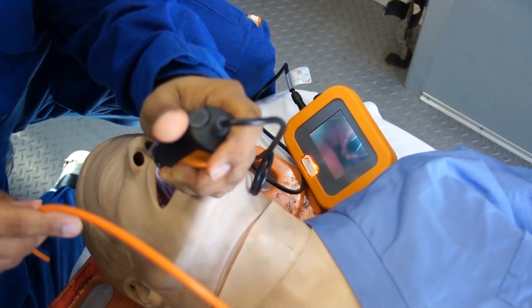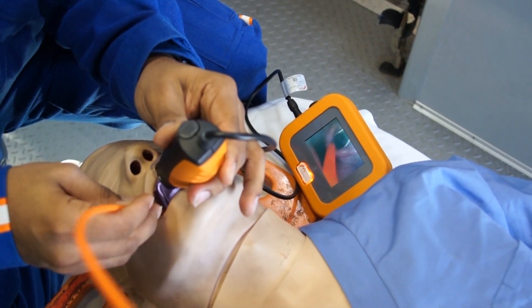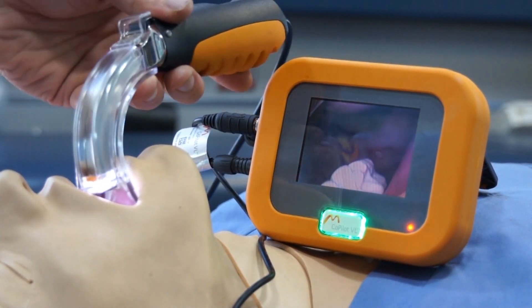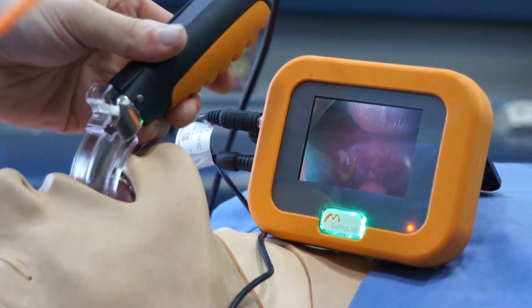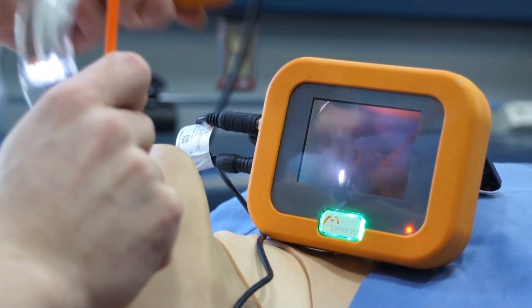It's all about finesse — just letting it sit naturally. And there it goes, your ideal view when using the co-pilot. Slide it down the port and that's it.